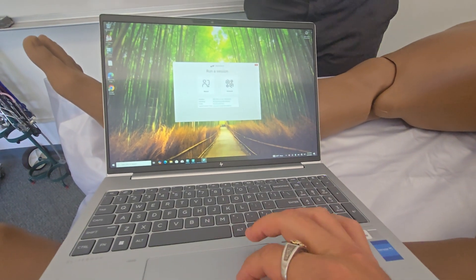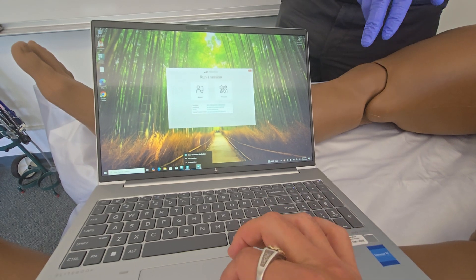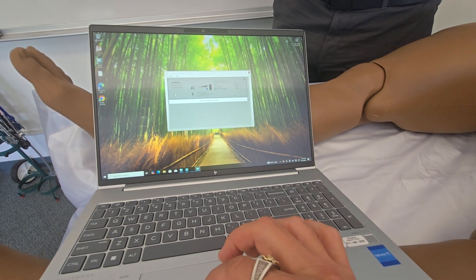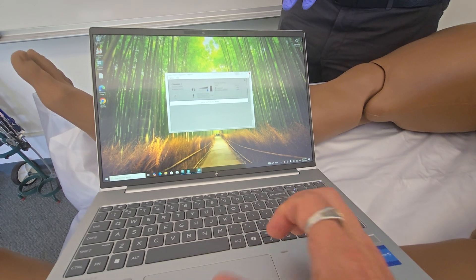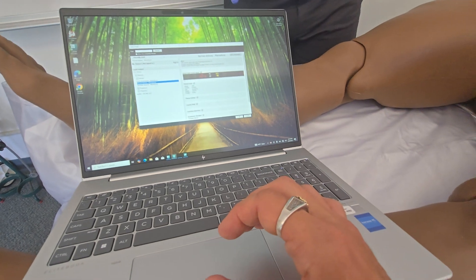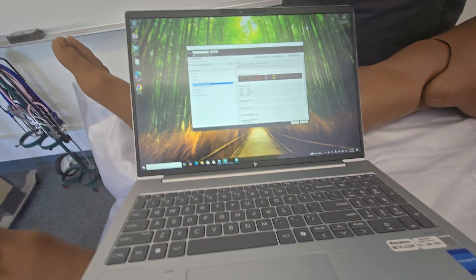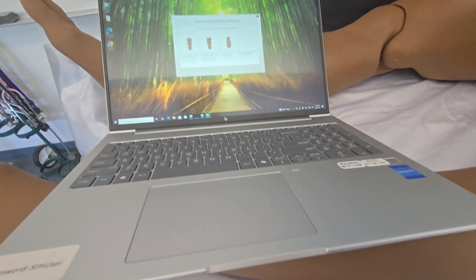We're going to hit manual mode, but first go into the voice conference application and mute that. That's the conferencing application to talk through the mannequin to the students if you have it set up in a control room. We're going to hit manual mode — that's for testing. The themes here represent the basic setup for patient information as well as the default vitals that will show when the session has the baby set up in OA. We're going to do an OA cephalic delivery.